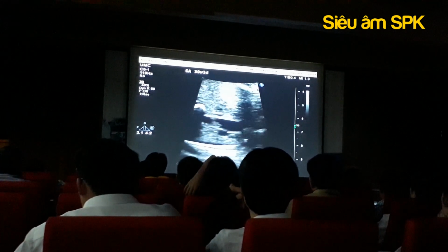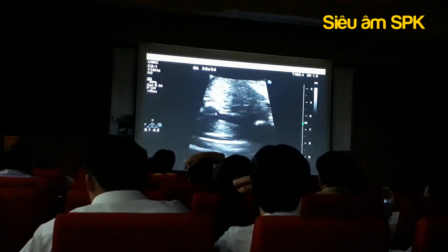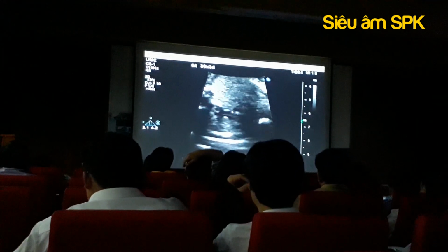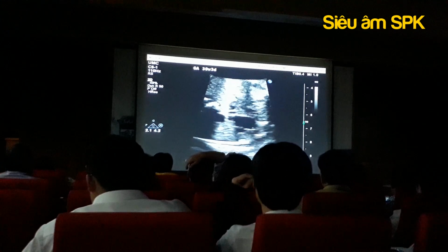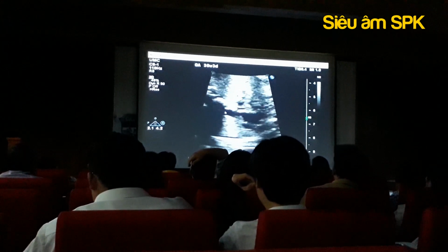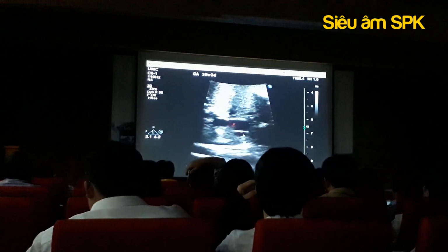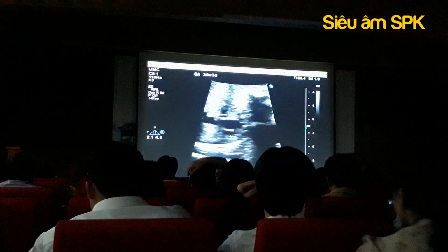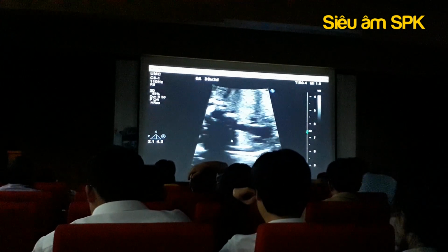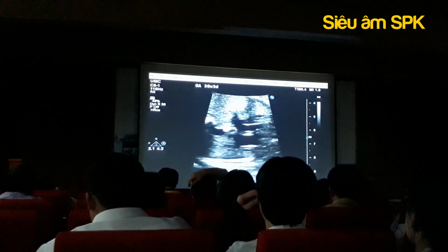This is again showing probably a little bit more clearly the trachea. And the right aortic arch with the superior vena cava being over here. And also shows the SVC and the trachea on opposite sides from each other.